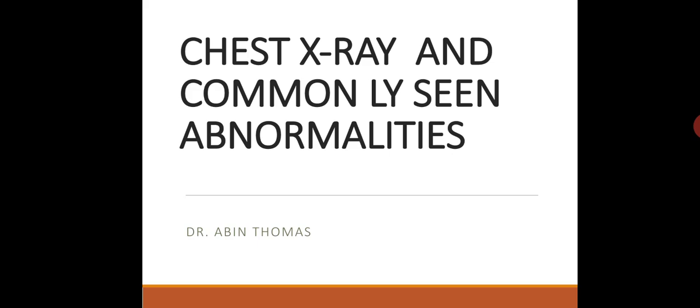This session will add on to the relevance of the previous session, and we will get a clear idea of the relevance of normal chest X-ray. So let's continue.